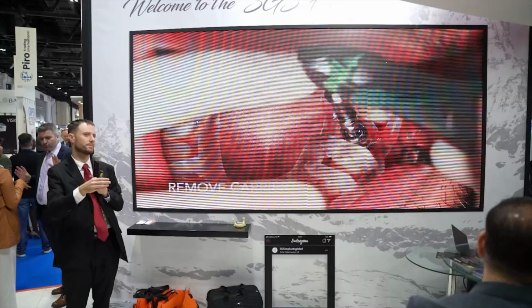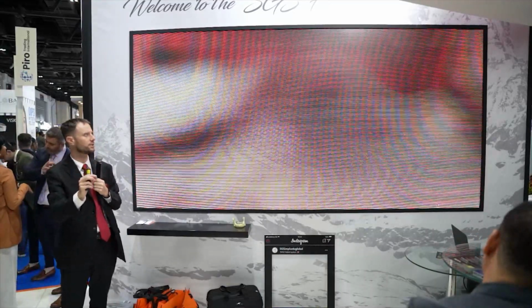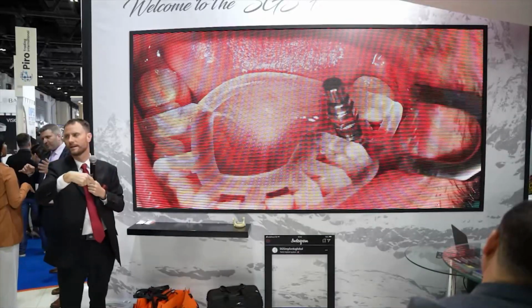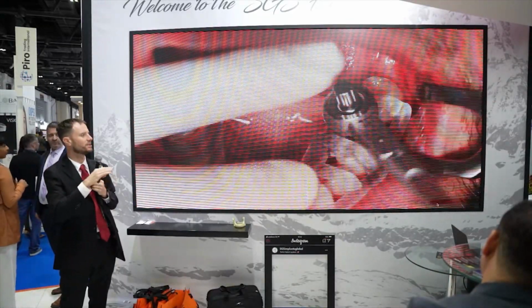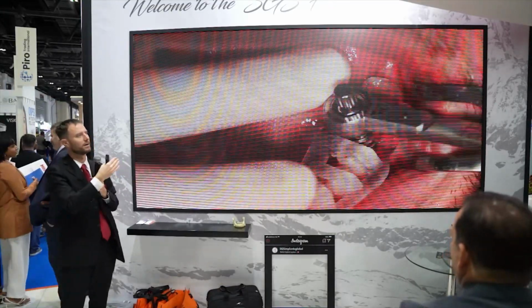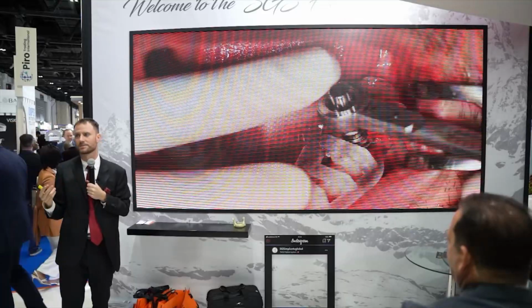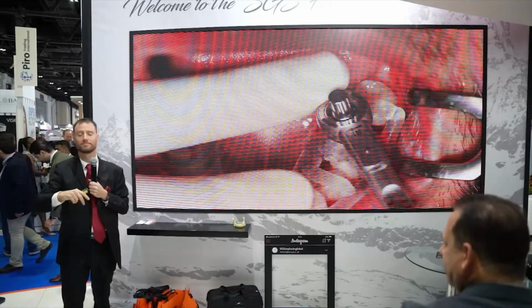In the beginning, it basically has a bit of free movement, and then once you have the initial, you go with a ratchet, and then you can have the guided placement. So there's no other chance to have any torsion or any distortion from this, even with these aggressive implant types.